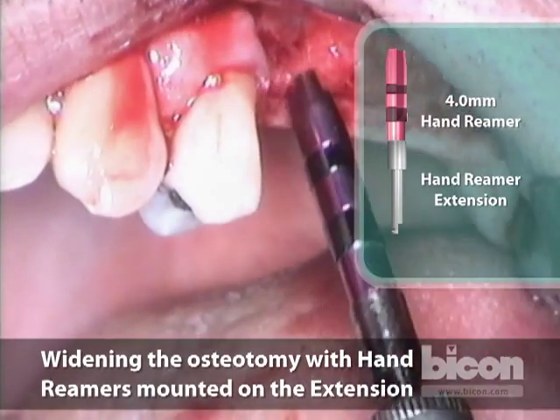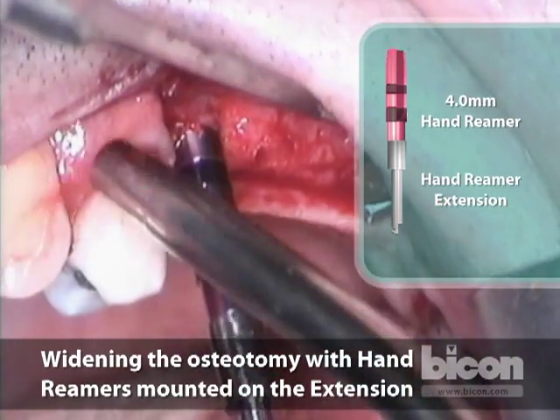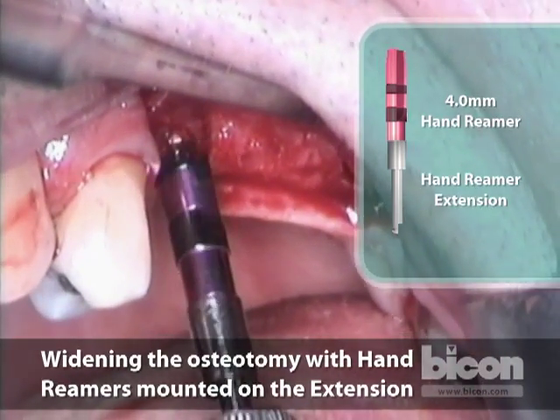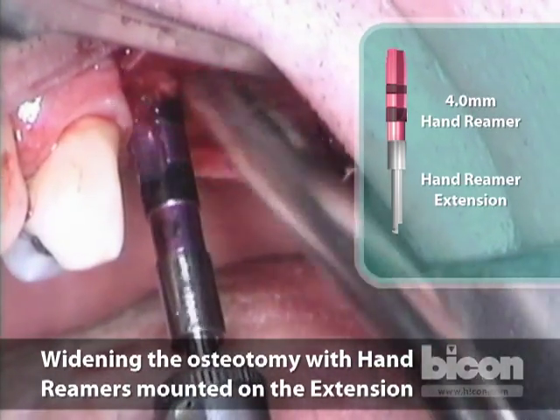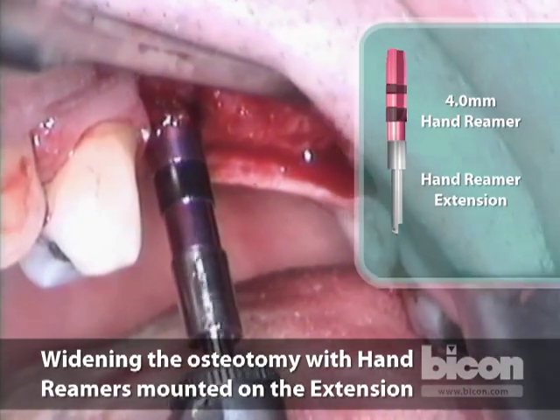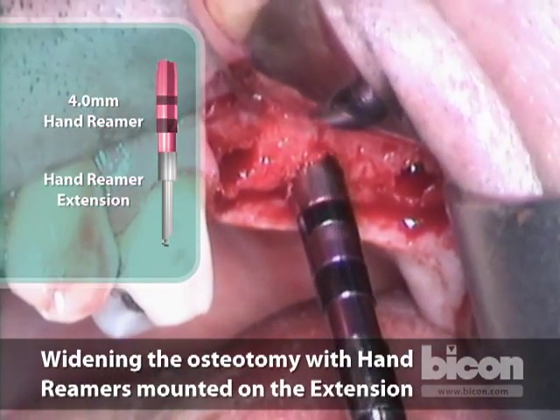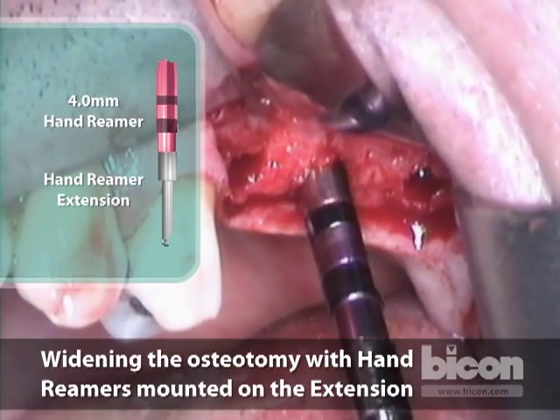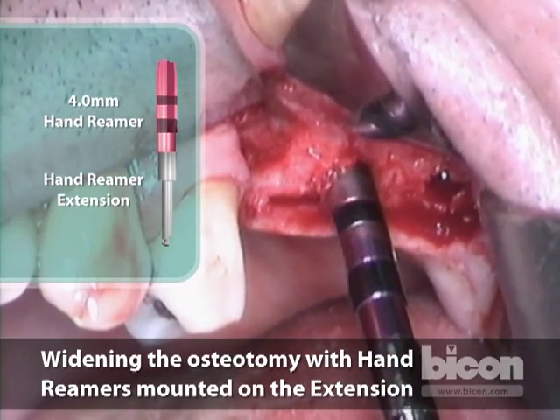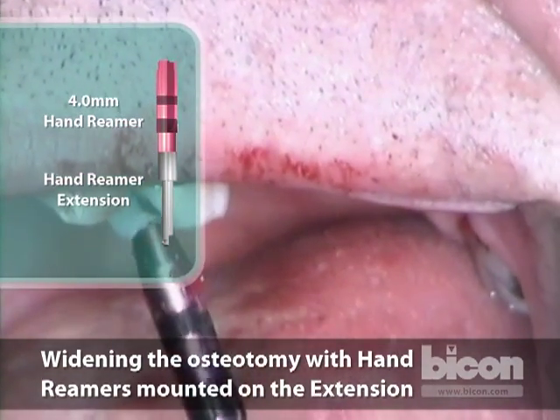We will now complete the osteotomy for the bicuspid, as I intend to place a 4x5mm implant in there. I want to place the implant at roughly 2mm from the top of the crest, so we drill to 7mm, which is in the middle of the first band. My intent with this one is to go to a 5x5mm implant. The hand reamers have the added advantage of being able to actually change the depth because of an offset at the very tip.